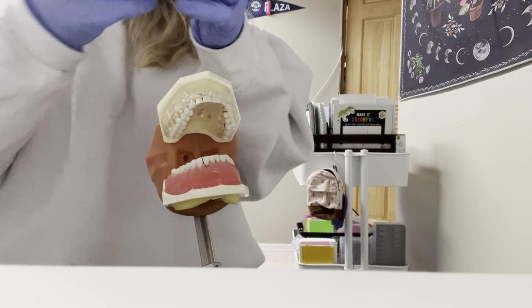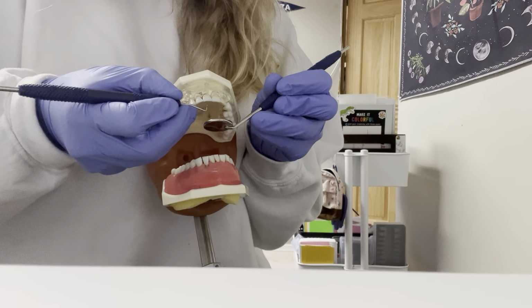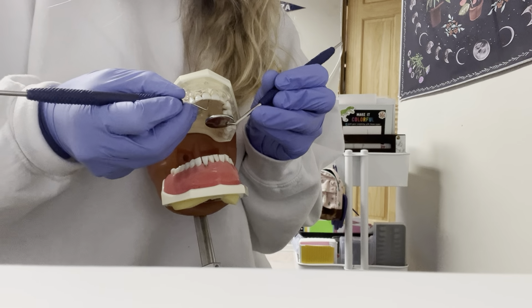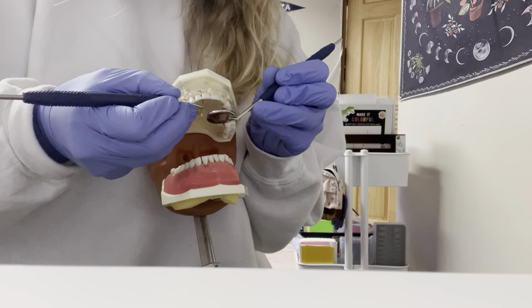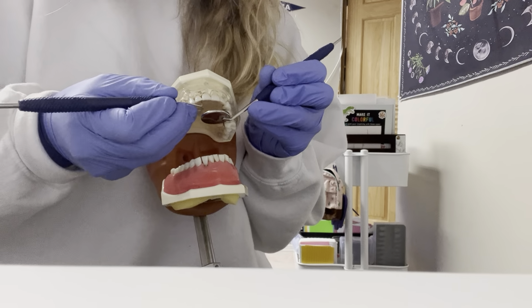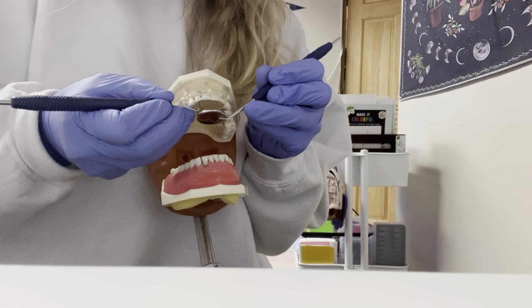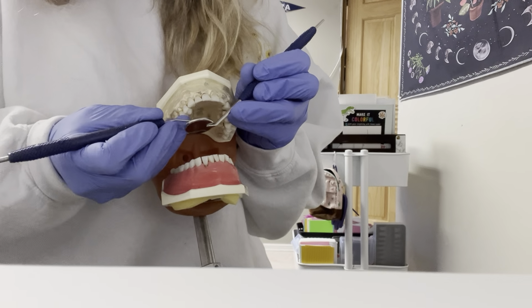So now I'm going to do the palatal side. I'm going to start with the mesial of the tooth first. Always end on an angle. Again, you always want to get 3 readings per tooth.